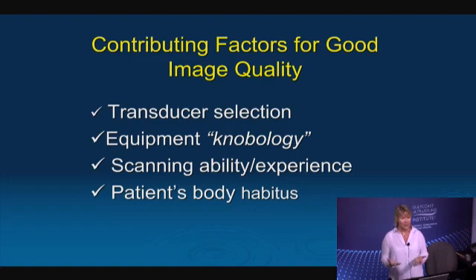So I call that the friends and family plan. They don't have to be real patients for you to practice scanning. Friends, family, co-workers, anybody you can find to scan, that counts as an examination.